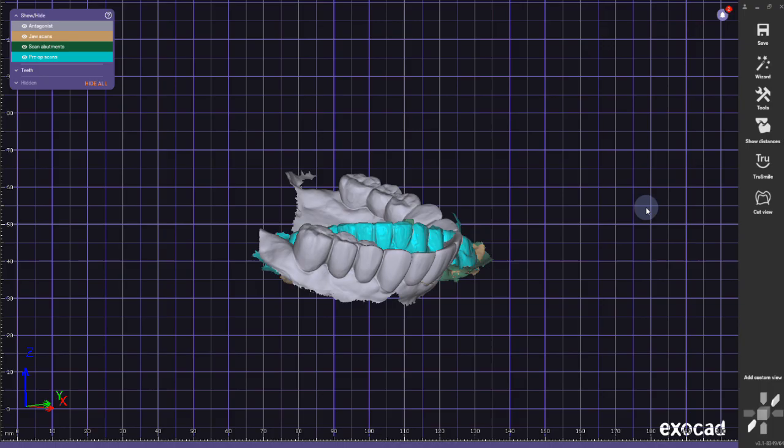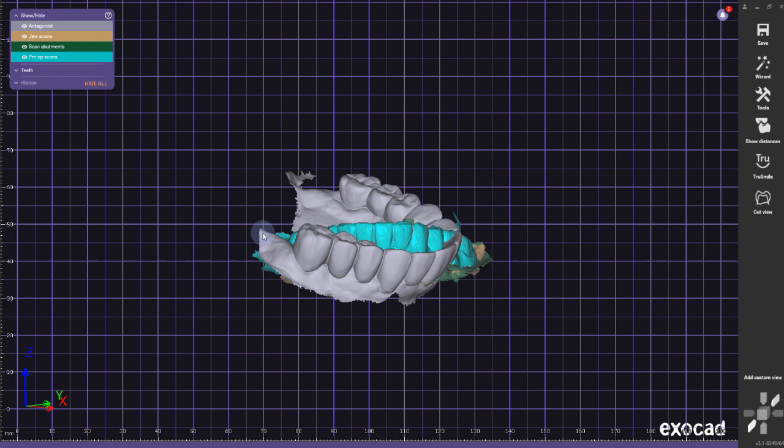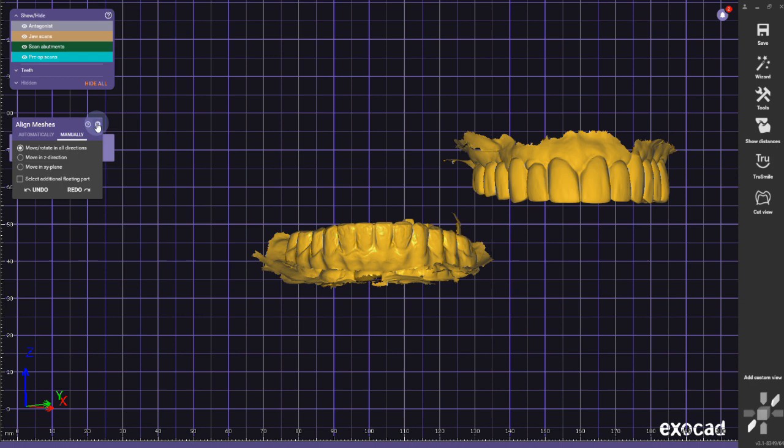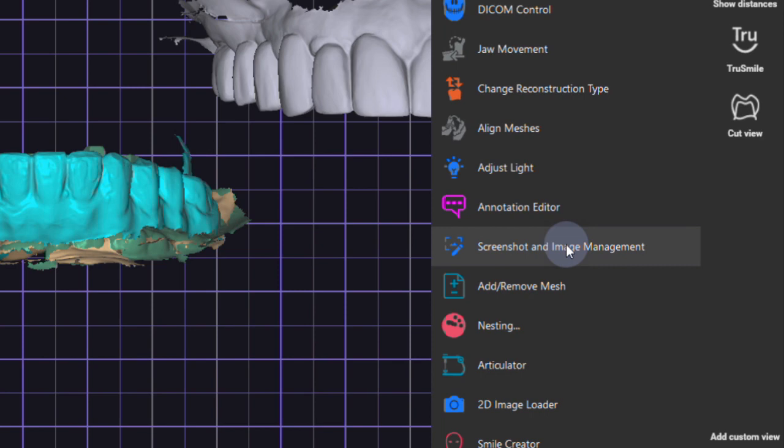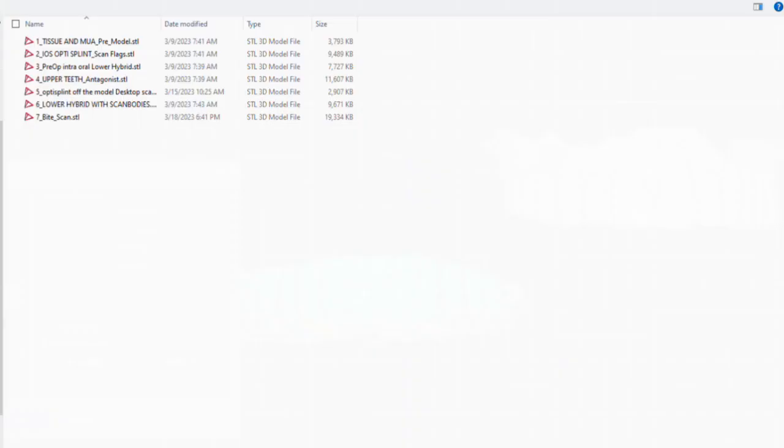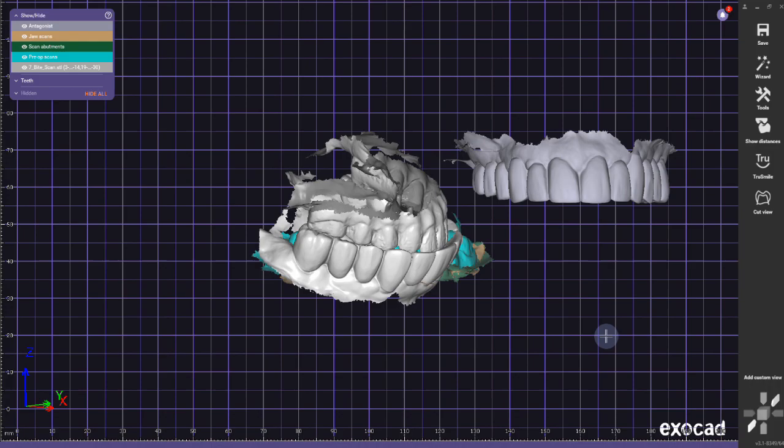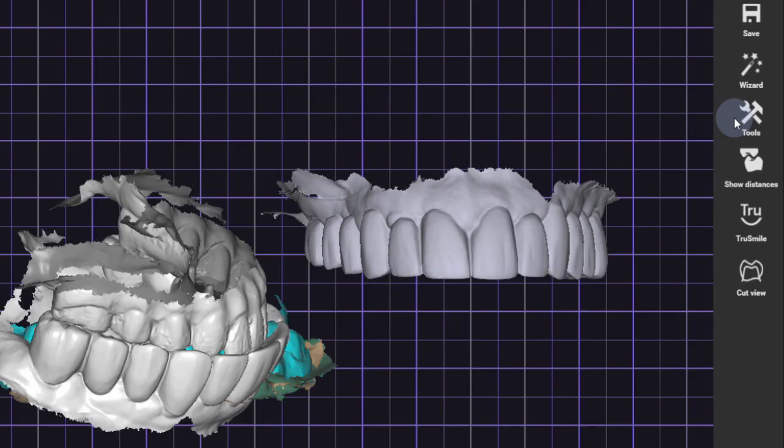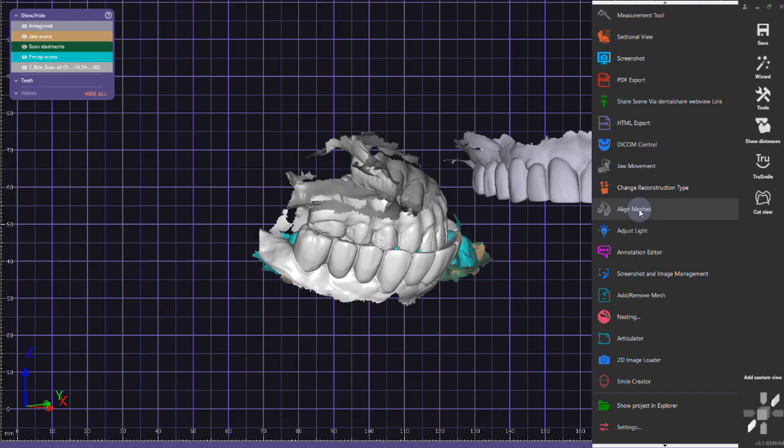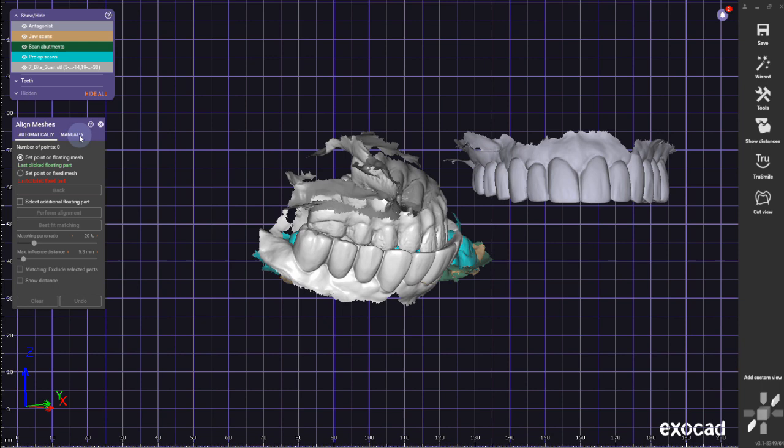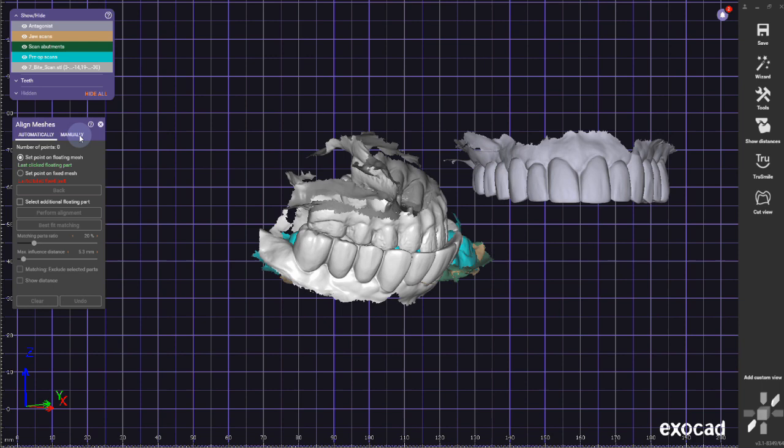Next, I have to align the antagonist. I'm going to click on tools, align meshes. First thing I'm going to move the antagonist out of the way. I'm going to close the alignment and I'm going to go again to tools. And this time I'm going to add a mesh—I'm going to add a generic mesh—and I'm going to choose the bite scan that I originally created.